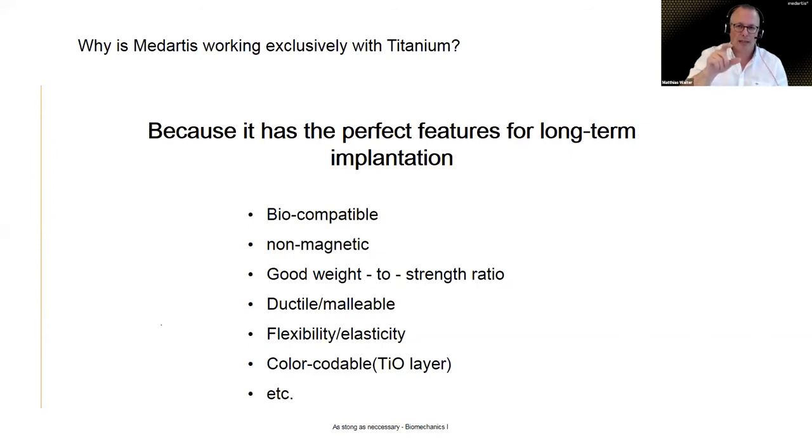So where the living is actually meeting the dead material, the metalwork, right? So we have to be careful there. Then obviously titanium, also the beauty for the ones who already appreciate this, titanium is color codable. So when you apply an anodization process, you can actually change the color appearance. So you can give it any color of the rainbow, blue, red, green, yellow, purple, doesn't really matter. And you can then utilize the color information for communication.